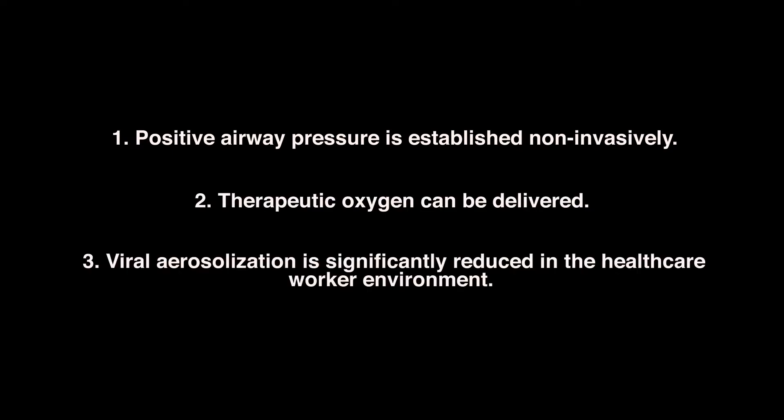When paired together, they offer three critical capabilities for the management of respiratory distress. First, positive airway pressure is established non-invasively. Second, therapeutic oxygen can be delivered. Third, viral aerosolization is significantly reduced in the healthcare worker environment.